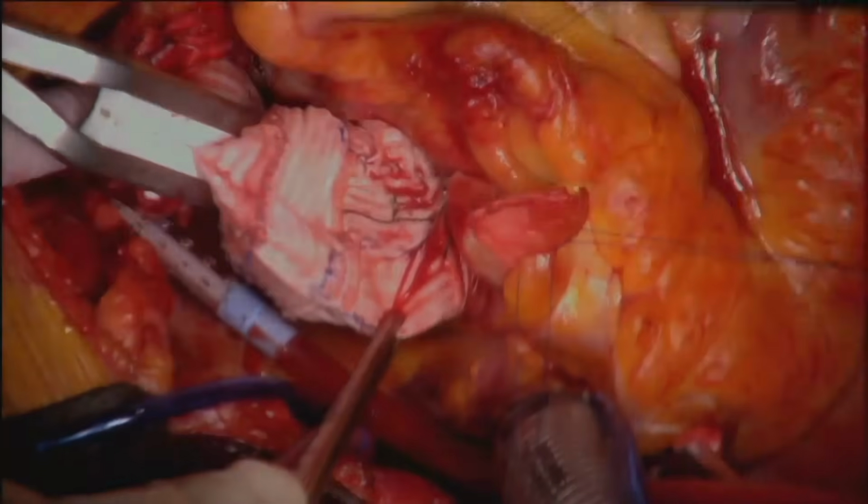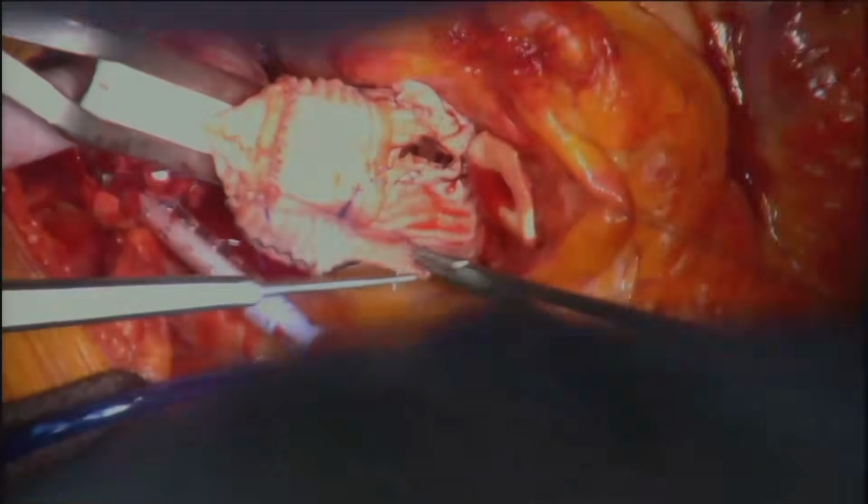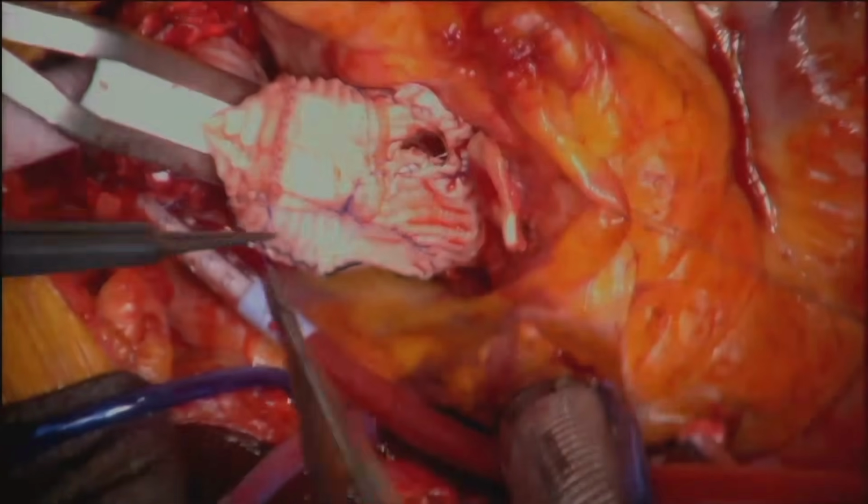The right coronary button was implanted into the anterior aspect of the graft with a running 6-0 suture.